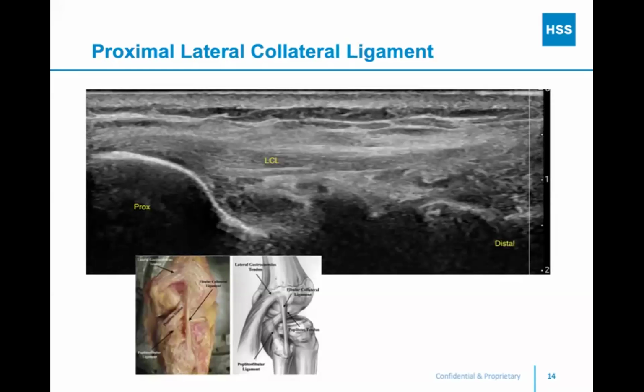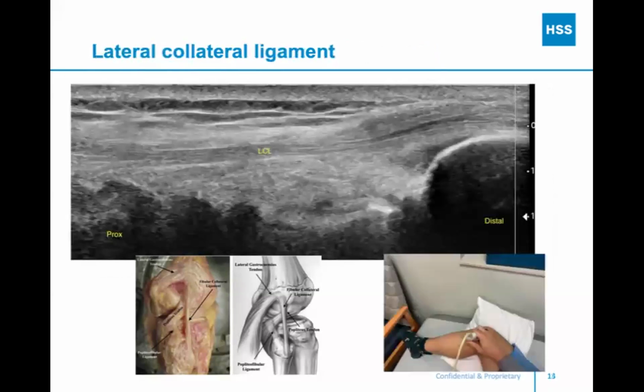But then, as you pointed out, that distal LCL is oftentimes another point of hang up for individuals who are just starting to scan. I think one of your other images had it a little bit better, but it looks to me like a hamburger. The LCL is the burger patty, and then the biceps femoris, like you have there, is wrapped around like a bun on top and a bun on bottom.